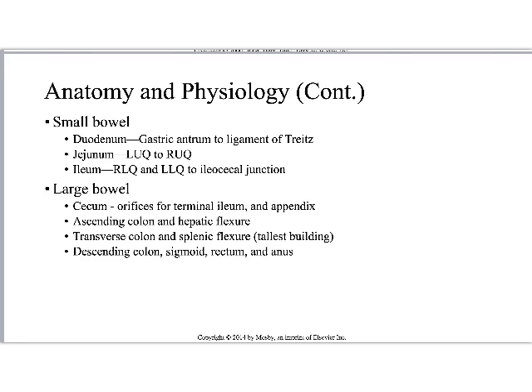It goes up the ascending colon, around the hepatic flexure. Hepatic's just the fancy Latin word for the liver, right? So right upper quadrant, across the transverse colon to the splenic flexure, which I've noted is the tallest building, and then down the sigmoid, descending colon to sigmoid, rectum and anus, right? The reason I've written tallest building there, and I was going to have a picture of the Empire State Building on this slide, is because that splenic flexure is the highest of all the colon flexures.